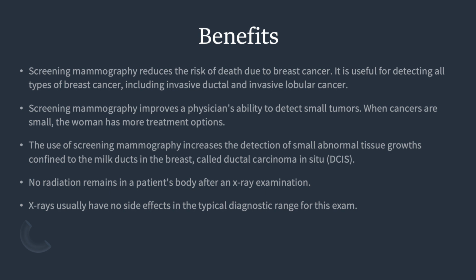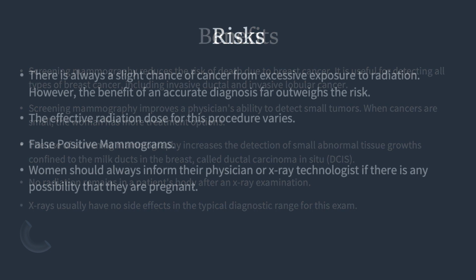Also, it increases the detection of small abnormal tissue growths confined to the milk ducts in the breast, called ductal carcinoma in situ (DCIS). No radiation remains in a patient's body after an X-ray examination, so X-rays usually have no side effects in the typical diagnostic range for this exam.